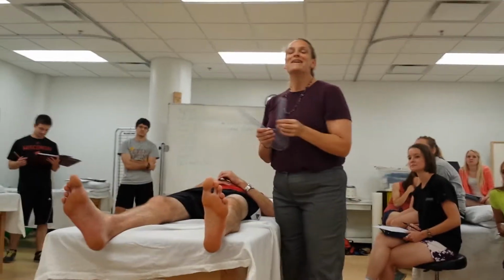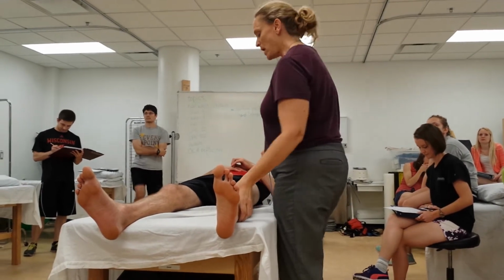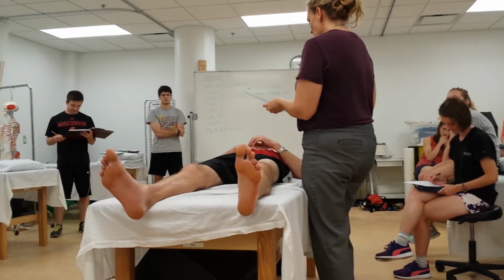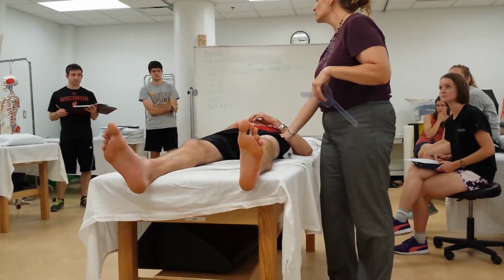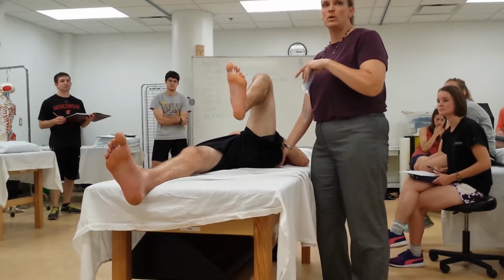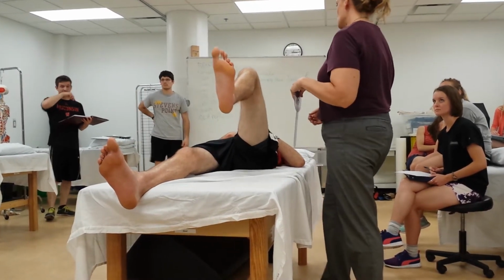Okay? All right. So the two other measurements that we're going to do in supine is adduction and abduction. So obviously for active range of motion, I would be monitoring the pelvis and I'd ask him to bend his knee up to his chest, would be my instruction. Okay? I would tell him to stop when he got to the place where I wanted him, where I felt there was movement, and then I would take that measurement.